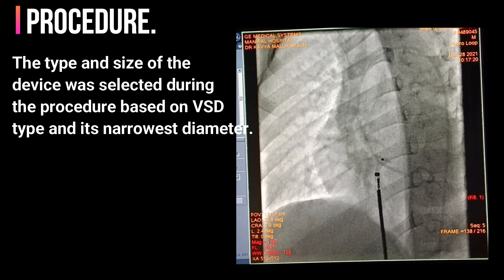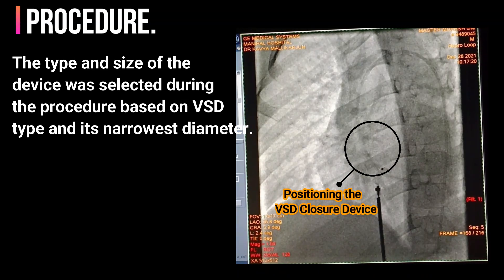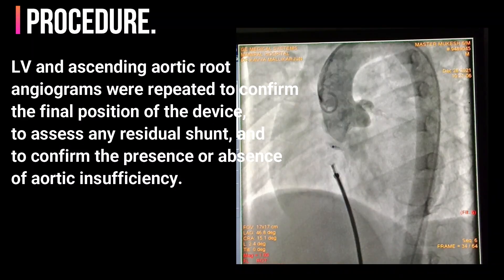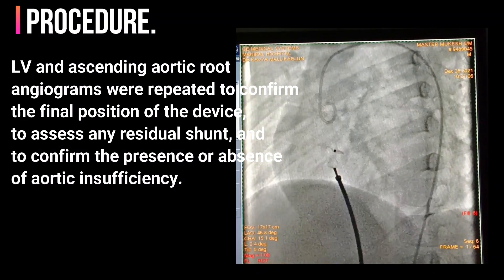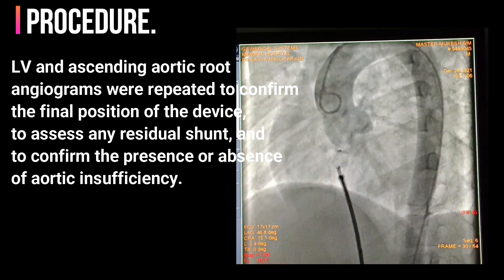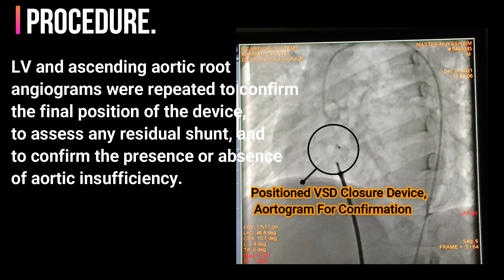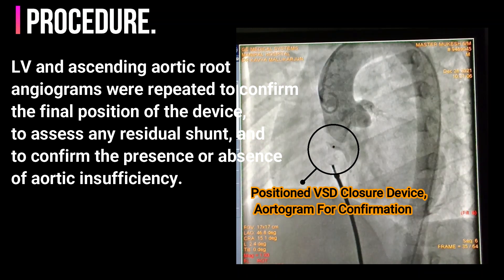The type and size of the device was selected during the procedure based on VSD type and its narrowest diameter. LV and ascending aortic root angiograms were repeated to confirm the final position of the device, to assess any residual shunt, and to confirm the presence or absence of aortic insufficiency.